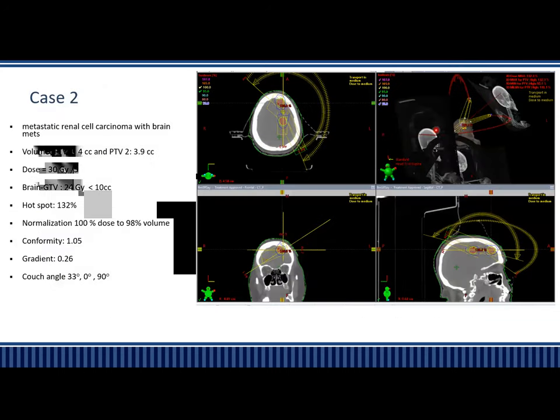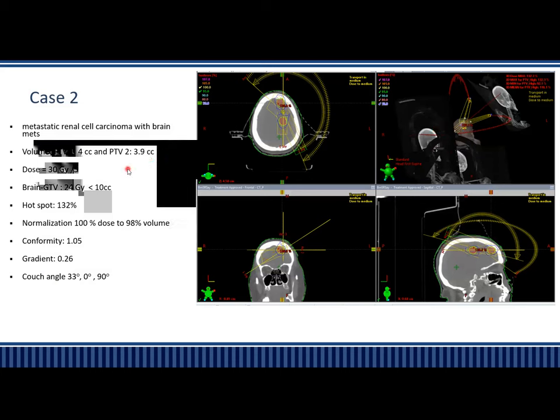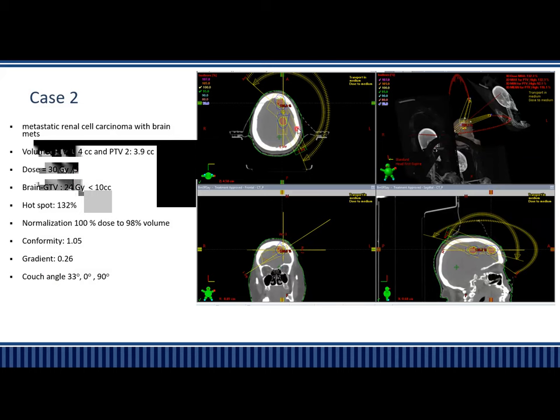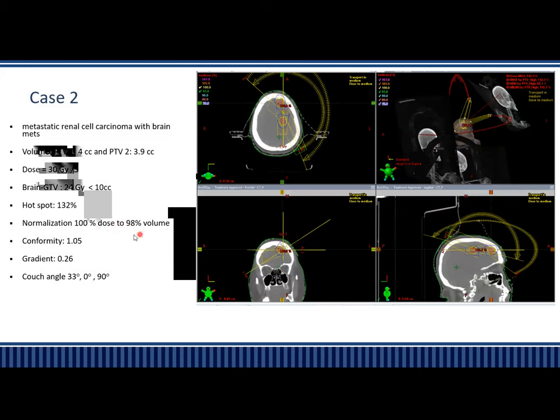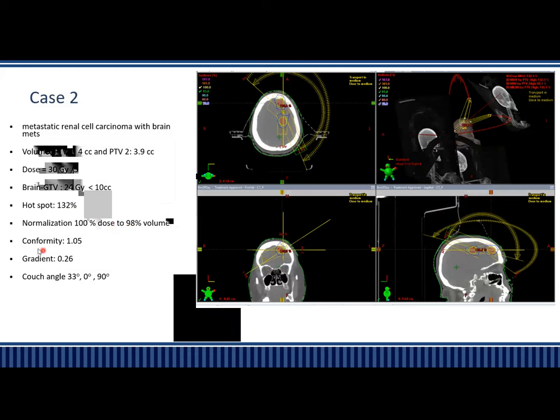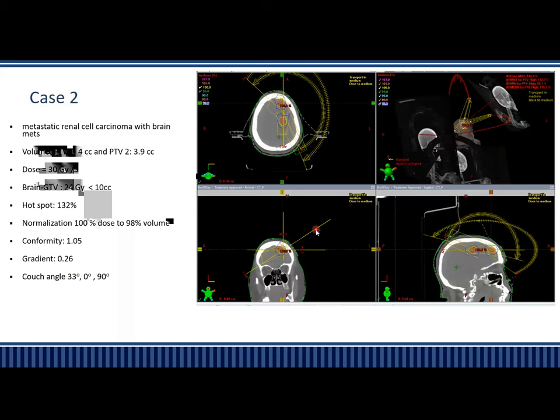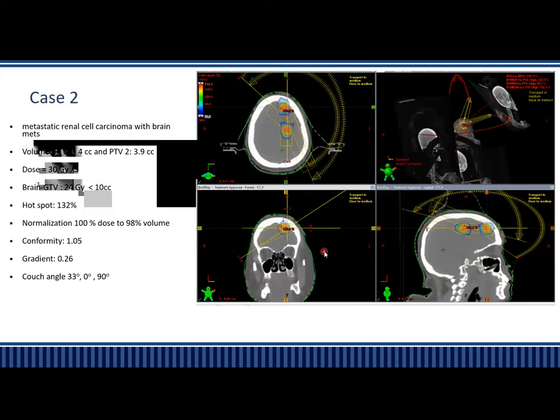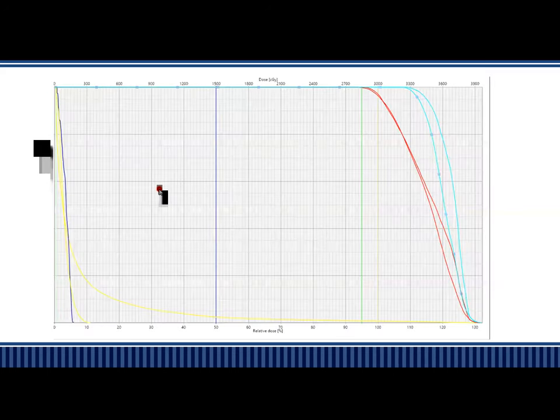Another case involves two brain metastases. PTV 1 has a volume of 4 cc and PTV 2 is 3.9 cc. The dose is 30 Gy in 5 fractions, and the brain minus GTV is less than 10 cc. You can see two volumes are treated — the more brain tissue was treated. Hotspot is 132%, normalization is done at 98% of the volume, conformity is good, and the gradient is another factor. Couch angles of 33, 0, and 90 degrees were used, with confined dose and low spillage visible in the DVH showing GTV 1, GTV 2, PTV 1, and PTV 2.